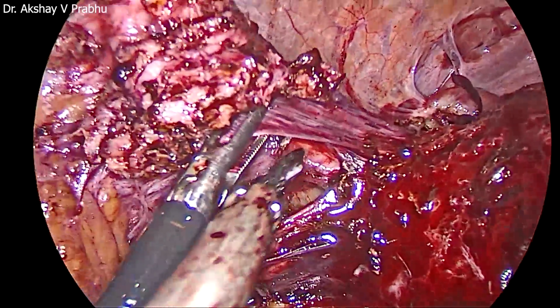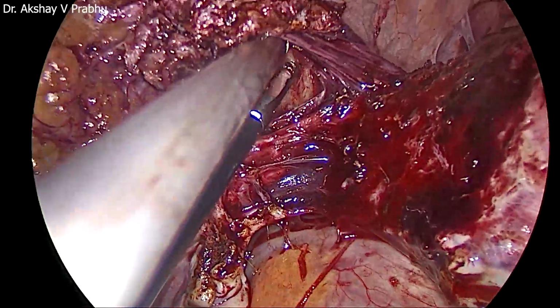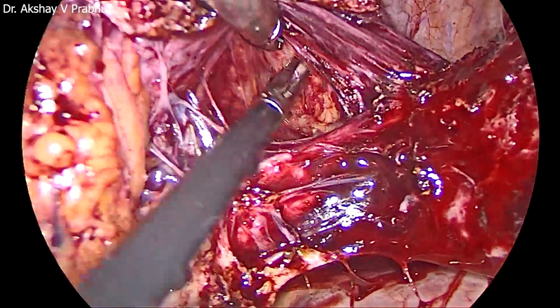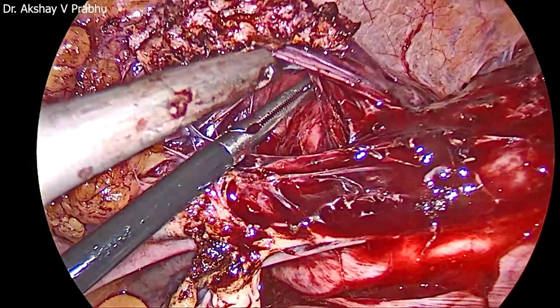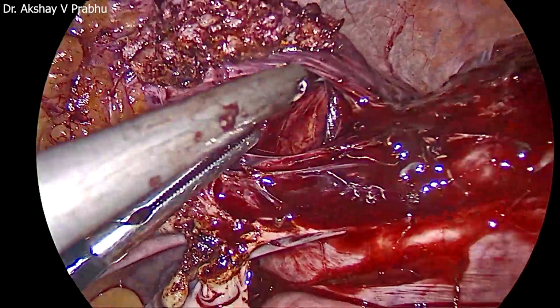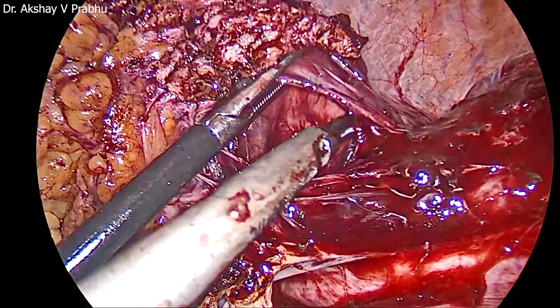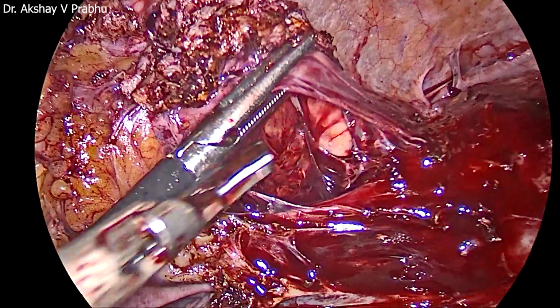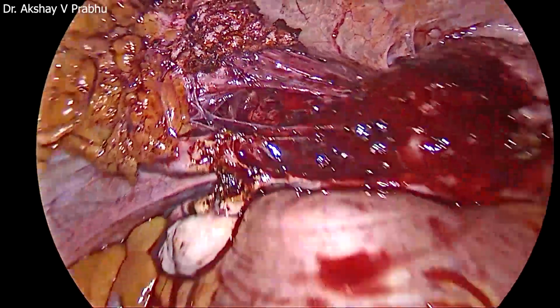As I said earlier, keep revising your margins, keep revising your tissue, see whether you are in the right plane. There is no hurry. Be sure and only then cut. It's better to be sure and cut rather than be sorry after cutting. So this was a case of previous 2 cesareans with severe adhesions. You can see how the adhesions are and how it's panning out.